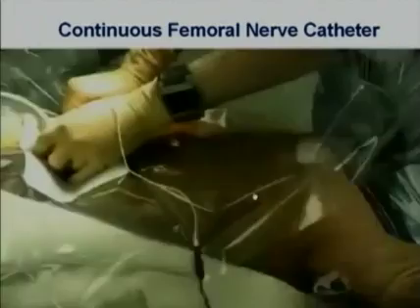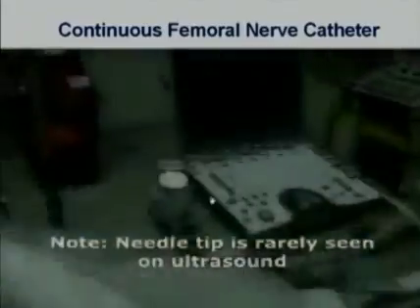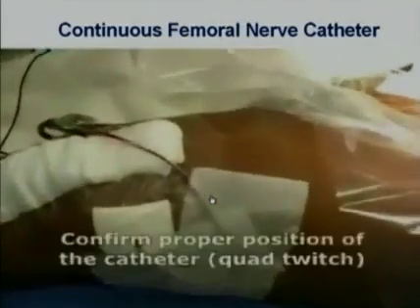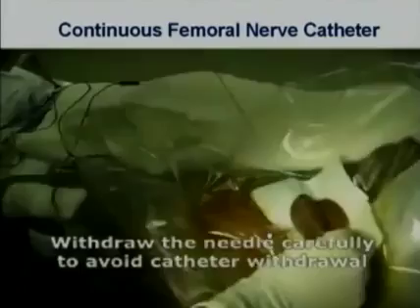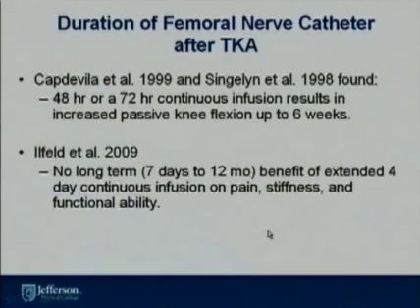A needle is inserted in-plane and when stimulating the nerve, you can visualize the quadricep twitch. A catheter is then threaded — this is a stimulating catheter, which can still be used to localize the nerve — and a bolus is given through the stimulating catheter. Studies have shown that maximum benefit for a patient is 48 to 72 hours, which helps with passive knee flexion up to six weeks. Beyond that, there may not be any benefits on pain, stiffness, and functional ability.